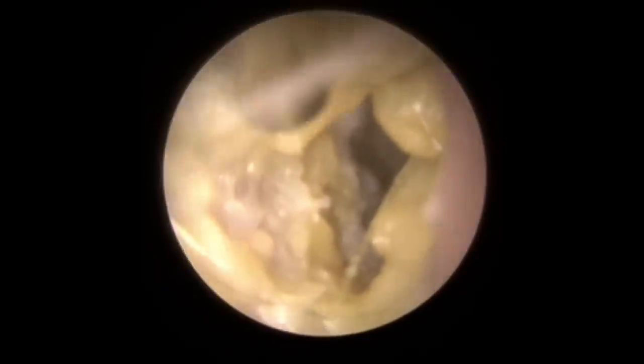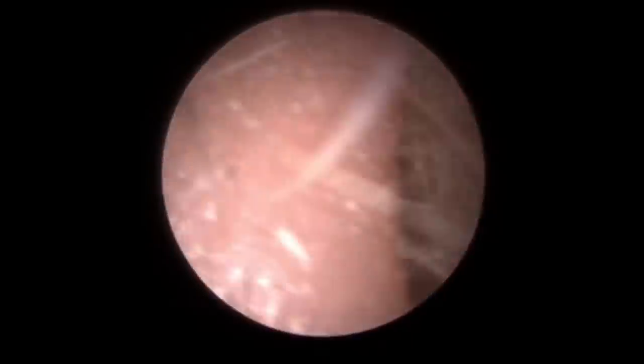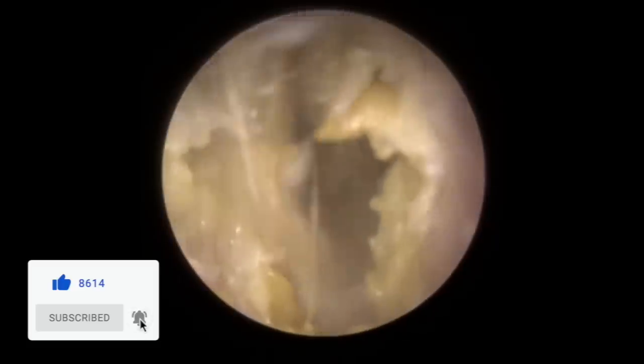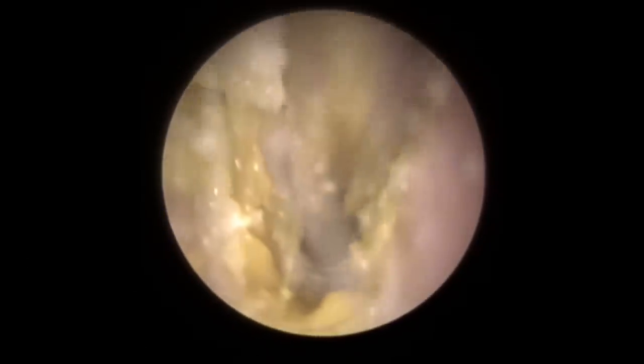What you can see here is this very light-coloured mushy material. That's actually debris from the fungal infection itself, but you'll also see some white pieces in there that look like remnants from using a Q-tip — very thin, fine, fibrous layers. Those are actually the spores coming from the infection itself. With fungal infections, the classic appearance is this mushy layer on top with a thick underlayer that's a mixture of dead skin and hardened up infected material. We're using the suction tube to suck down and pull away this material from the canal wall.